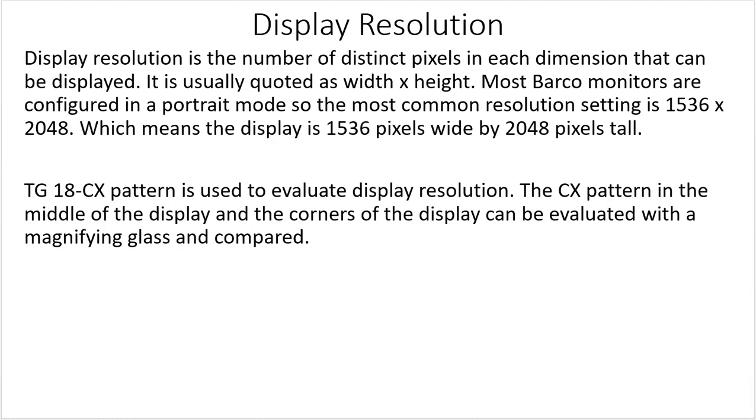Display resolution. Display resolution is the number of distinct pixels in each dimension that can be displayed. It's usually quoted as width times height. Most Barco monitors are configured in a portrait mode, so the most common resolution setting is 1536 by 2048, which means the display is 1536 pixels wide by 2048 pixels tall.